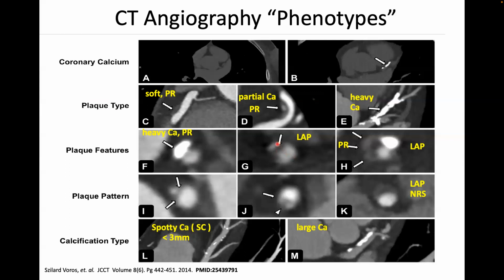And if you can visualize the whole lesion such that you see the lipid core of the lesion, and in pathology, when you cut these lesions open, they do sometimes have this pocket of lipid inside them. That is a sign of a lesion that has higher probability of rupturing and causing you a major heart attack. So this low attenuation plaque is a significant sign for risk.